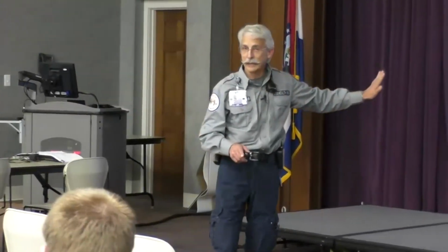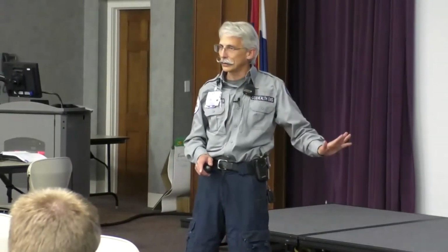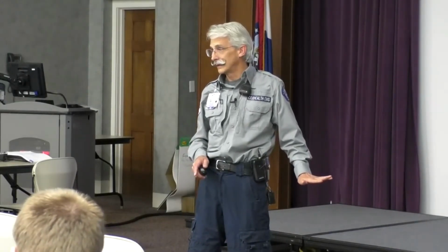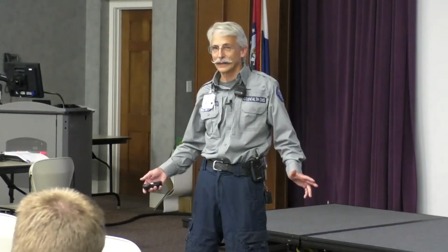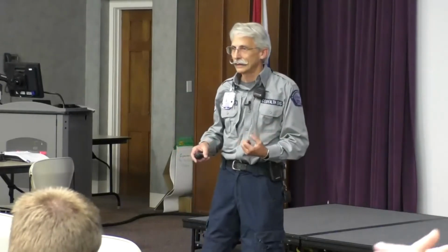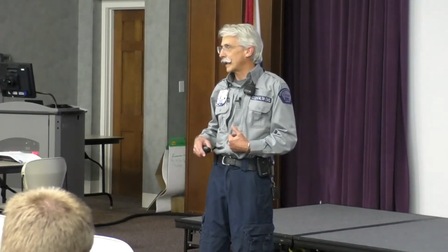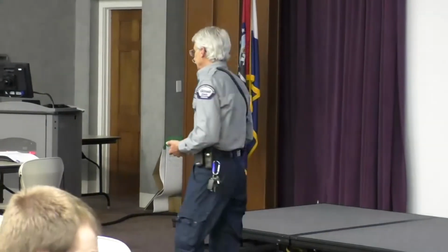They may still be having an MI. The other thing I don't know is if this is a new left bundle branch block, then the MI may be causing it. How's my patient presenting? Still important. It's still all about that. So I just kind of ignore that fact of the EKG to a certain degree, and I can tell the hospital what it's got, but it doesn't have to make a lot of treatment decisions for me. How is my patient presenting?